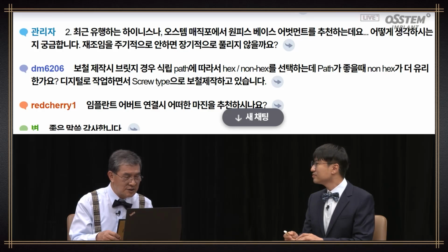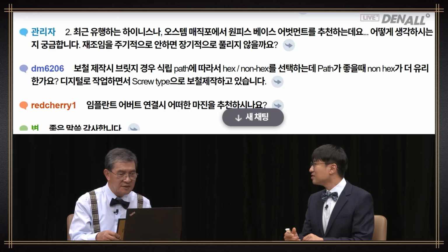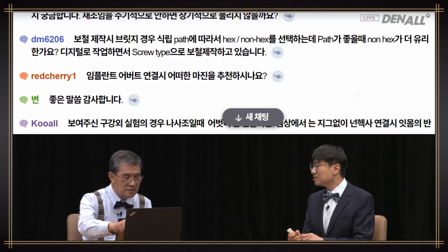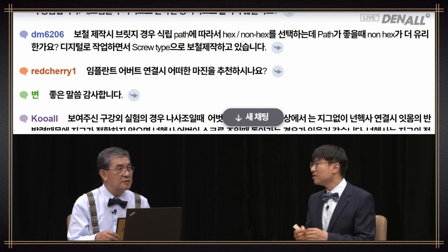In the case of a bridge, depending on the path, I choose whether or not to use hex or non-hex. If the path is good, will it be more favorable to use non-hex? I use digital dentistry and fabricate the screw-type prosthesis. In multiple cases, I don't think you should use internal conical type as a screw-type implant. The abutments need to be in precise contact. Hence, if you use a screw type, there can be stress leading to fracture of the implant.